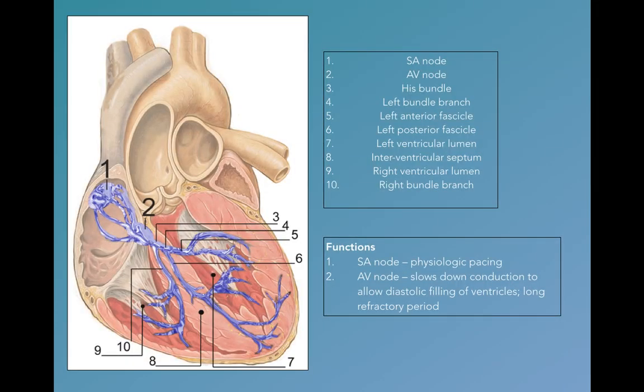And here's a picture showing all of that. You can try to match the numbers to the name. And I think I hit on everything else here.